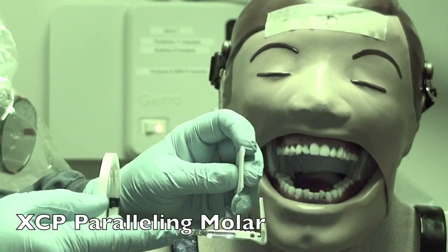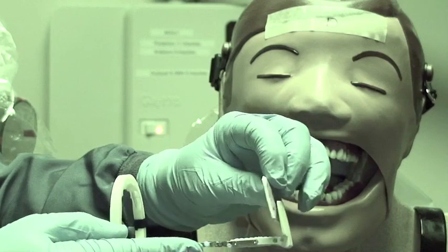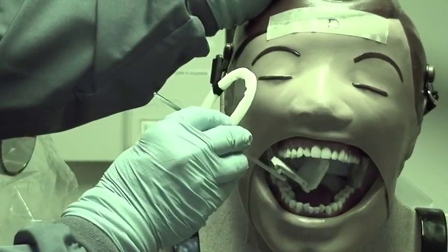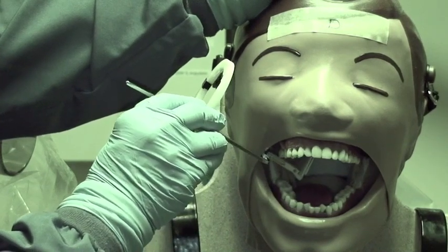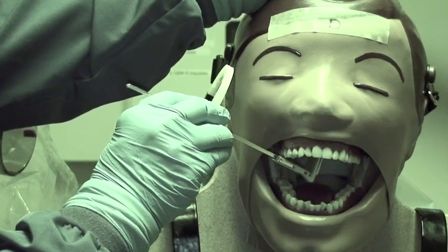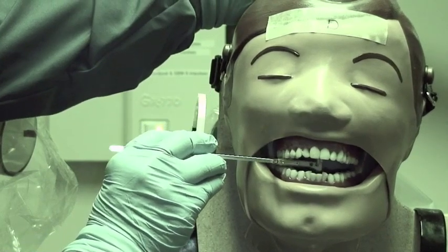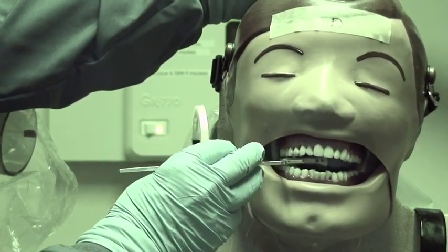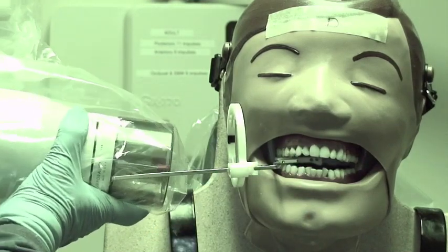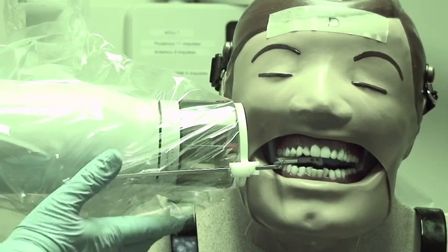Now moving to the XCP holder. Put the dot on the film into the incisal edge slot of the holder. For the molar view, go in on an angle and place the film on the teeth. The front of the film is at the mesial of the second premolar. Because we're doing the paralleling technique, the film should be away from the teeth. Then line up the PID with the ring for the paralleling technique.